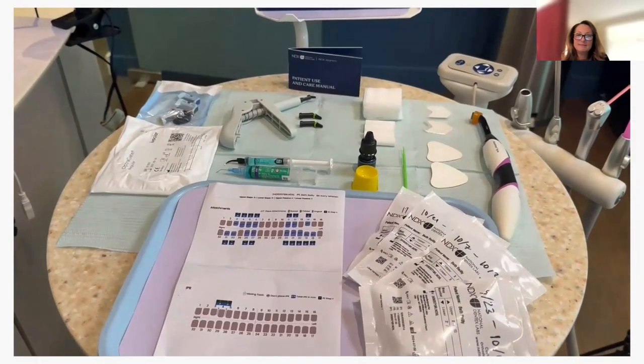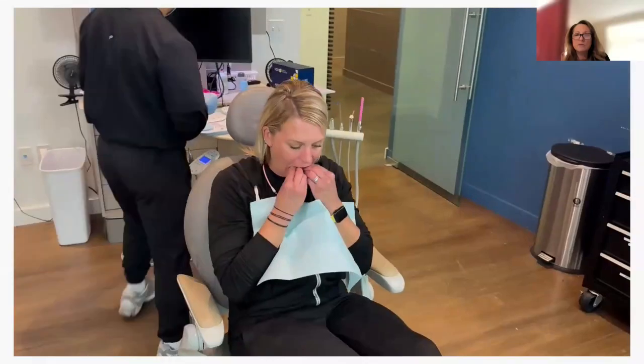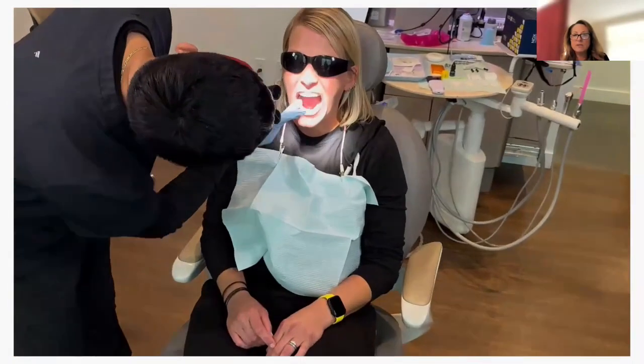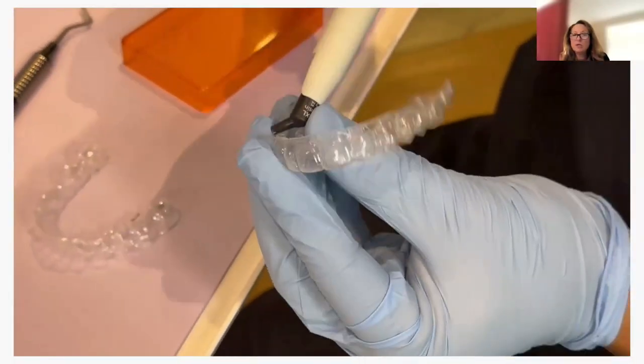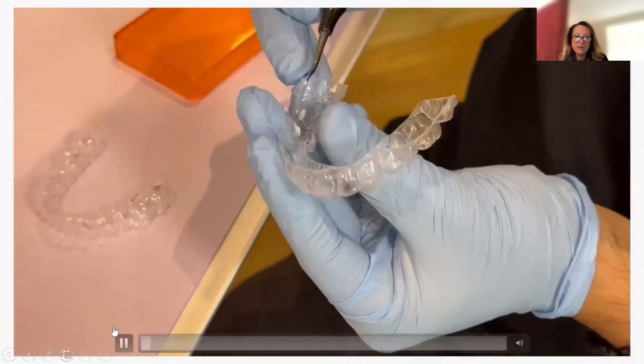So we're going to play this a little bit here. So right here, she's trying in her aligners without any attachments. And he's checking the fit to make sure it seats all the way. He is loading up the composite. I'm going to pause this right here.